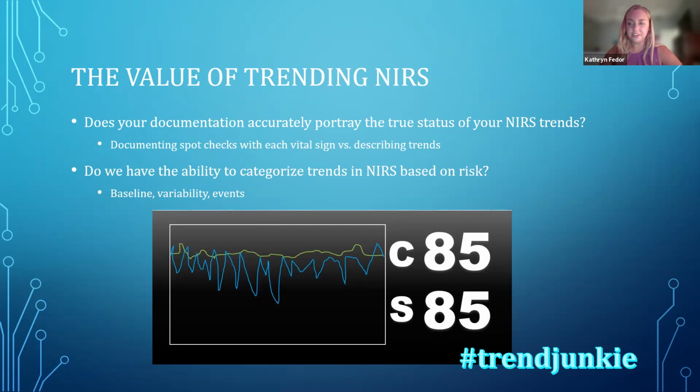We've had a lot of good dialogue with our bedside team and our nurses regarding how we can make a trend an absolute value, and how do we make it valuable? We've started to look at other areas of medicine that are documented and assessed using trends.